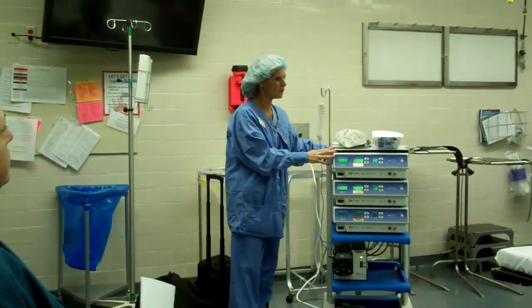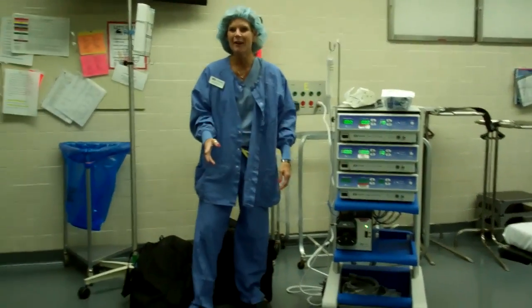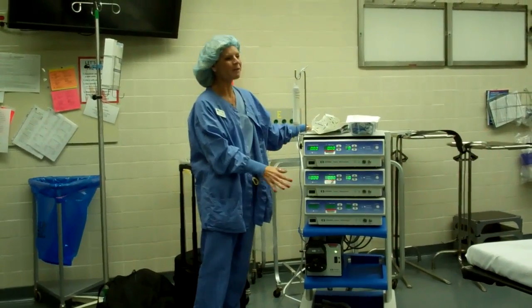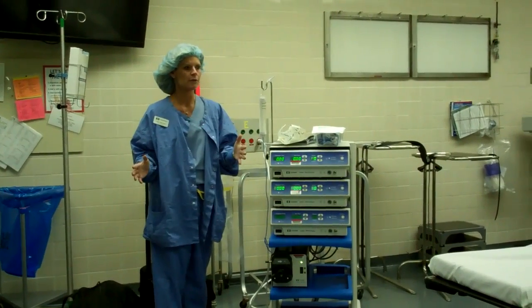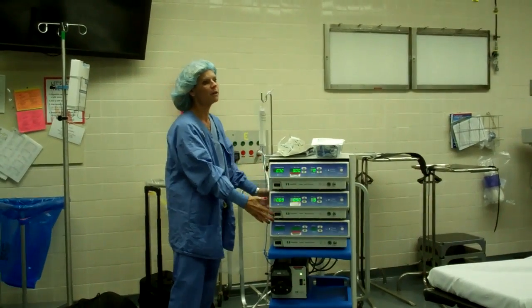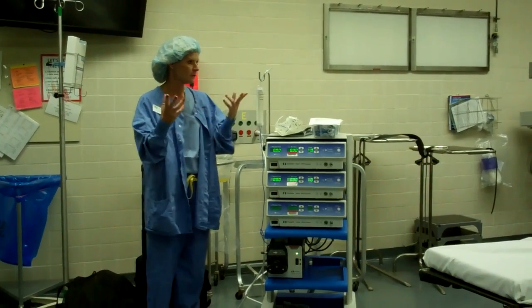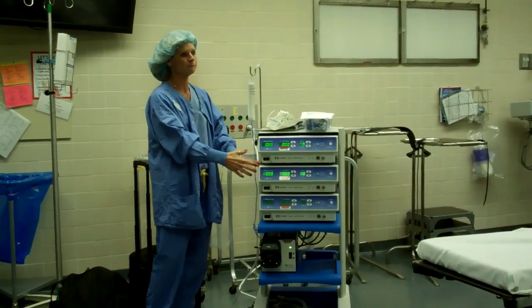This is the microwave system. There are three separate generators. They can be separated, so if you have a case in the OR and another case over in IR, you can separate these generators. You have one pump. The pump is used only for laparoscopics and over in IR for percutaneous. Otherwise, it's just the generators.